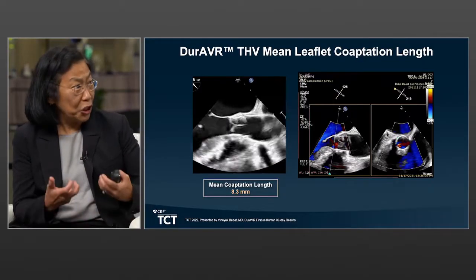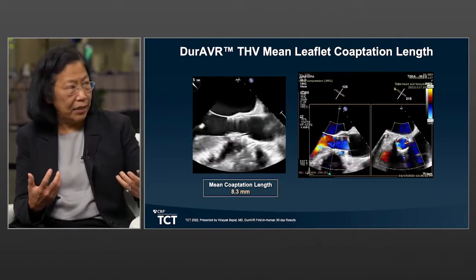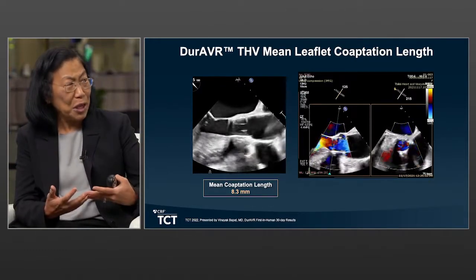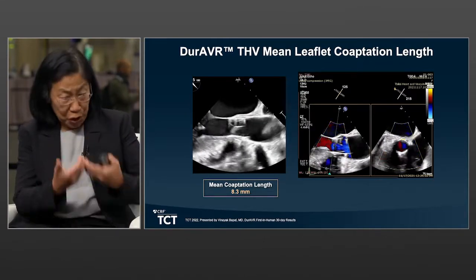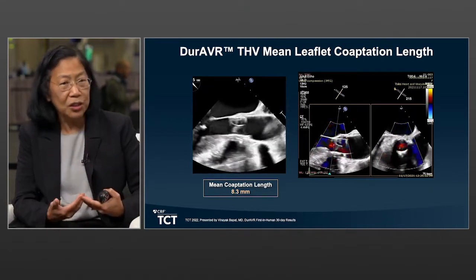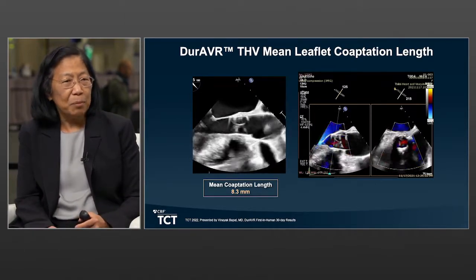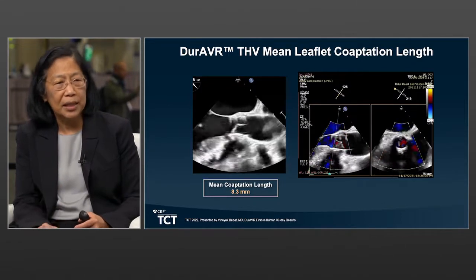Yeah, I think the beauty of this valve is its very long coaptation zone, but also the shape. I'm totally fascinated by the fact that the leaflets are indeed shaped like the normal leaflets. And so there's a couple of things that I think probably happen because of that shaping of the leaflets. One, the opening is going to be much more natural, much more like a native valve. But two, the closure forces may actually be less because it's shaped to be closed. And so it's opening with the force of the ventricle, closing kind of naturally, perhaps even with less force required to close it than in some of these other valves that we have. And so I'm fascinated by the shape of the valve and how that's going to really impact the hemodynamics.